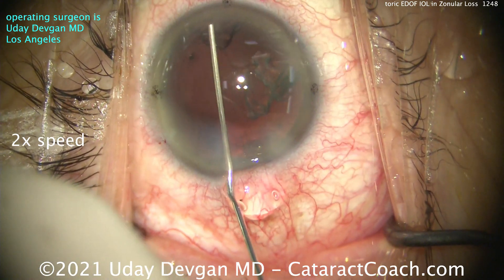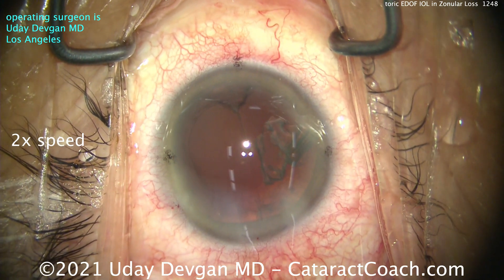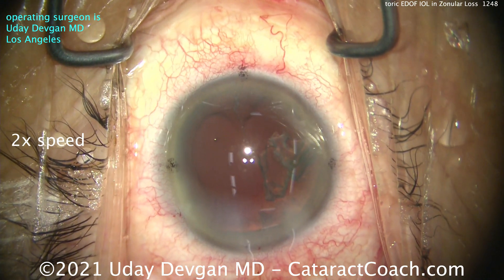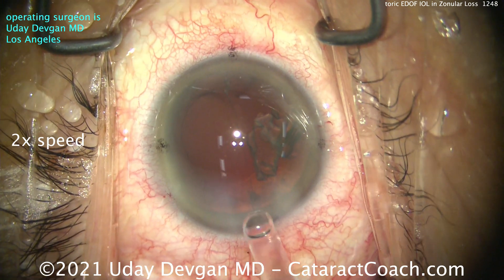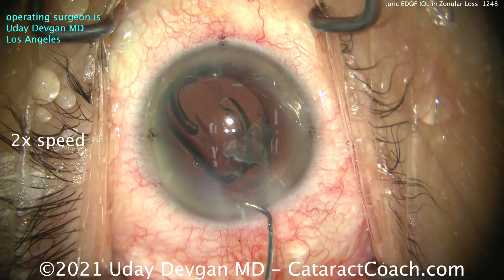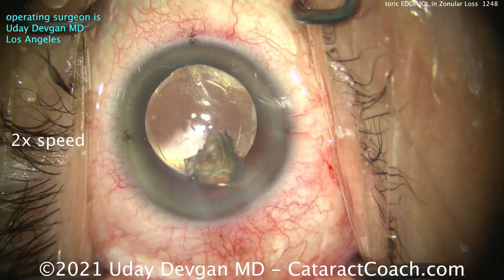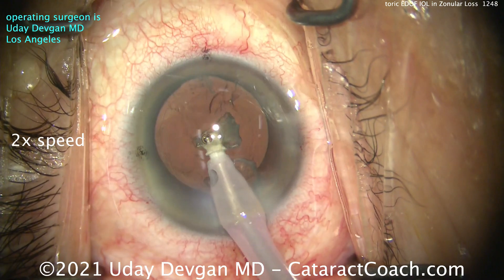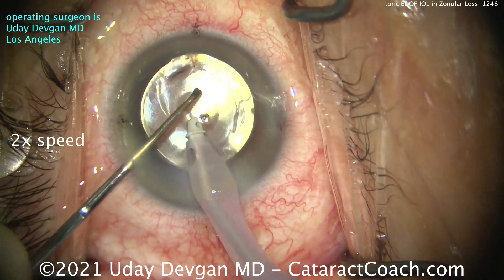We still have to get the rest cleaned up and get the lens in. We've got to make an assessment — can I place a single-piece acrylic lens in the capsular bag? There's some cortex and some epinuclear shell left. I'm putting in more viscoelastic. Remember, the CTR is going to hold all that cortex it traps right up against things, so we want to avoid that. Maybe I can do a bimanual approach. We made an extra incision just to be sure. Here comes the lens — we're going to take out the last bit of cortex and epinuclear shell after the lens is in the bag. Lower the infusion and lower the flow rate — half both of them. Let's take this last piece out, nice and easy.